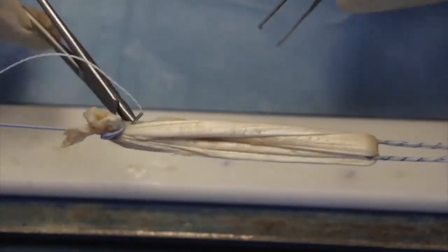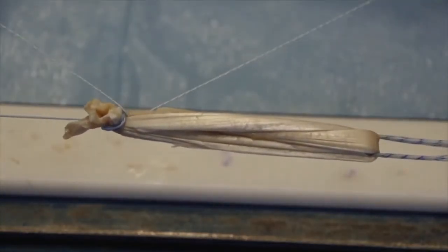The graft is whip stitched with a continuous non-absorbable suture from distal to proximal, and then from proximal to distal to reinforce the distal site of the graft.